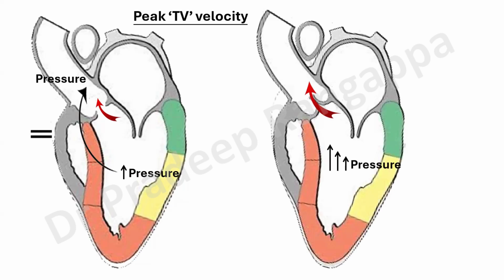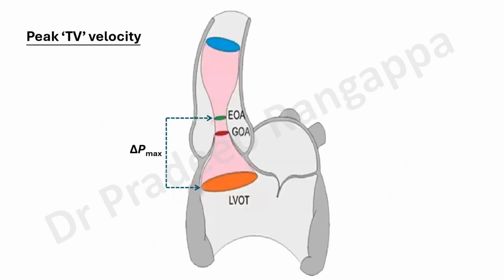In aortic stenosis, the LV pressure has to increase supranormally to eject the blood out of the LV into the aorta. So the LV pressure is more than the aortic pressure, and that leads to a transvalvular gradient, which is the difference between LV pressure and aortic pressure. This we spoke about when I spoke about aortic stenosis. That's why a pressure gradient gets built up. This pressure gradient becomes more accentuated because the velocity of the blood significantly increases from the LVOT to the effective orifice area.